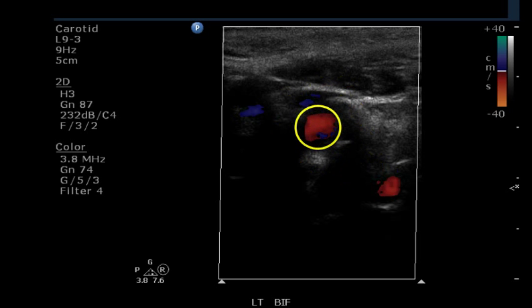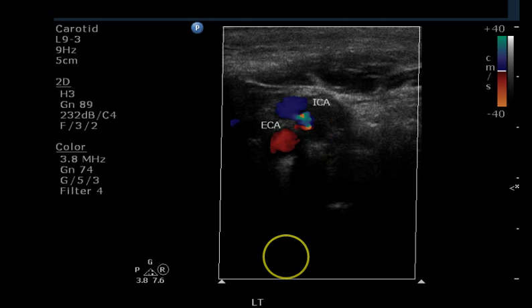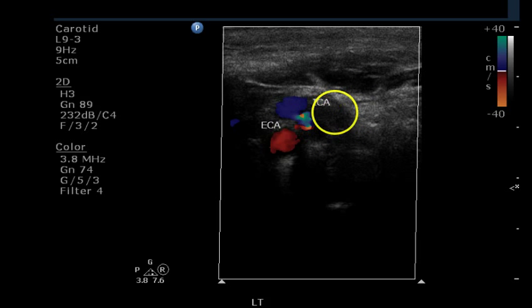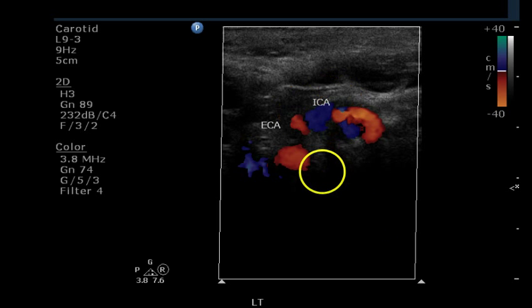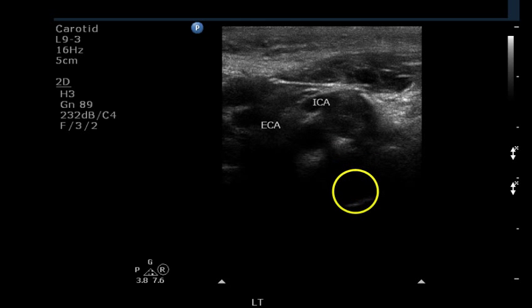Grayscale image shows a little bit of intimal thickening or non-shadowing plaque. At the bifurcation the ICA is toward the top of the screen with a lot of plaque surrounding it and the external carotid below. At the narrowing, the vessel extends much further than it appears — this is all hypoechoic plaque. Another bifurcation view with the ECA medial and ICA lateral shows it getting bigger beyond the area of stenosis. Grayscale doesn't help much on this image due to the hypoechoic nature of the plaque.